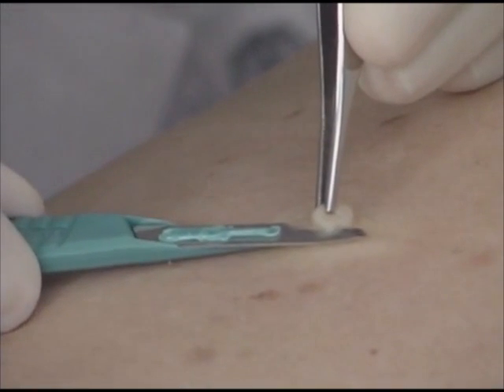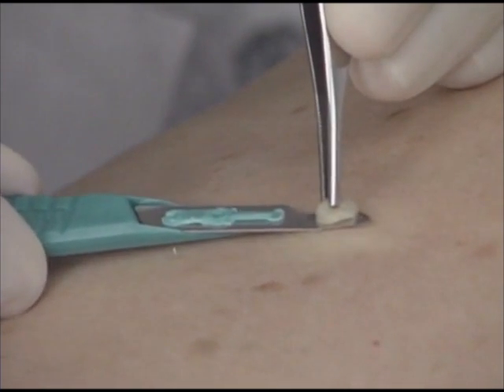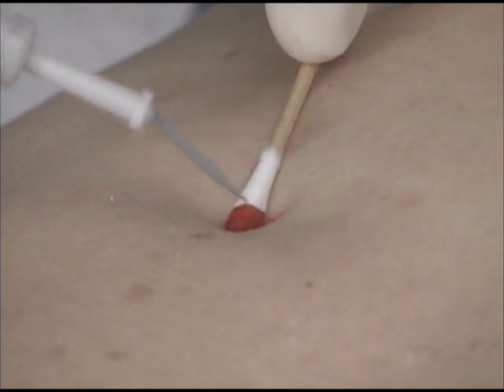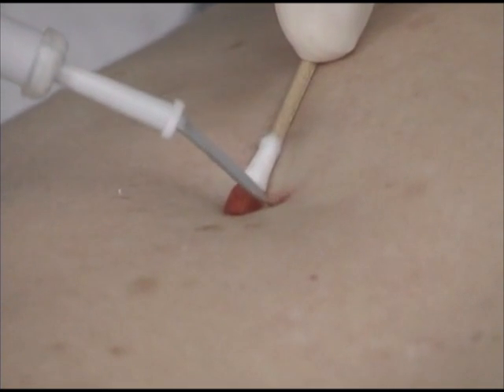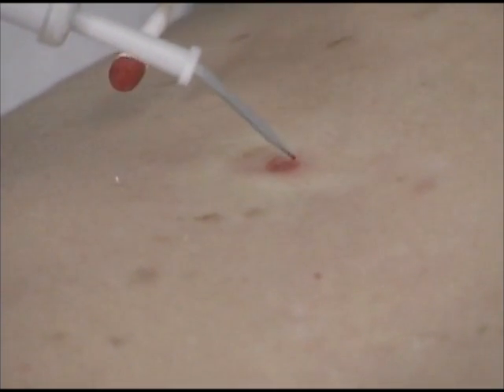Here is the full electrodesiccation of the base of the lesion and complete hemostasis. Electrosurgery is a great method to stop the bleeding that occurs during biopsies and excisions. We will demonstrate this with shave, punch, and elliptical excisions. Here is the shave biopsy of a possible basal cell carcinoma. Electrosurgery is a particularly useful method for hemostasis when it is desirable to destroy any remaining tissue after the shave specimen is removed. This may be beneficial after removing a vascular lesion, a benign nevus, or a suspected basal cell carcinoma. The skin is anesthetized with 1% lidocaine and epinephrine. The differential diagnosis for this flesh-colored papule is an intradermal nevus versus a basal cell carcinoma. Hemostasis is obtained using a cotton-tipped applicator for pressure and then electrocoagulation. The pathologist determined that this was a basal cell carcinoma.